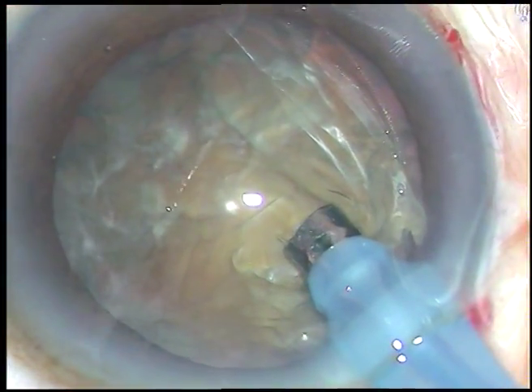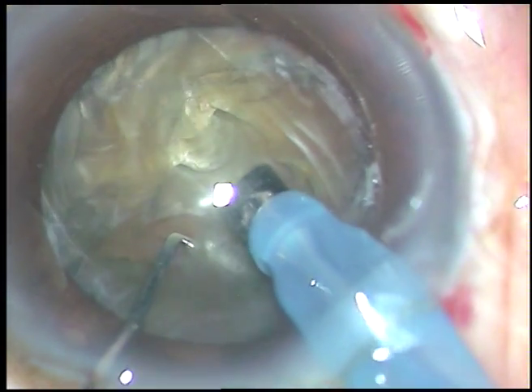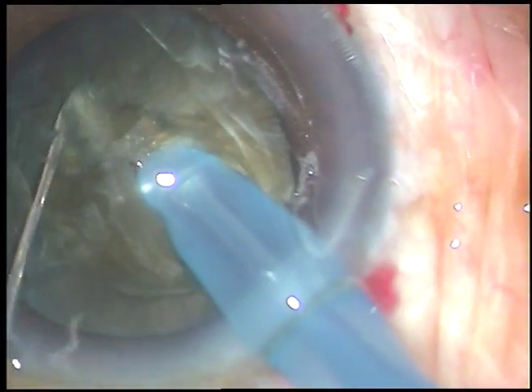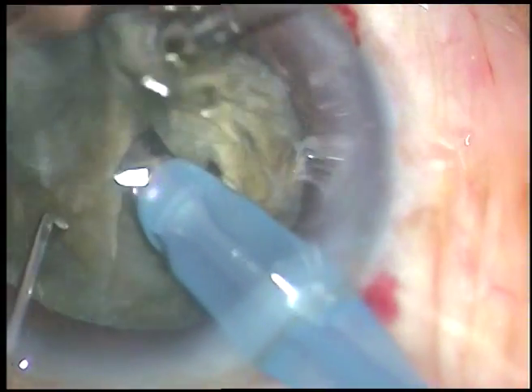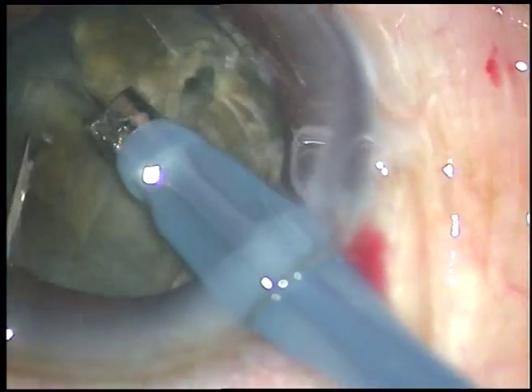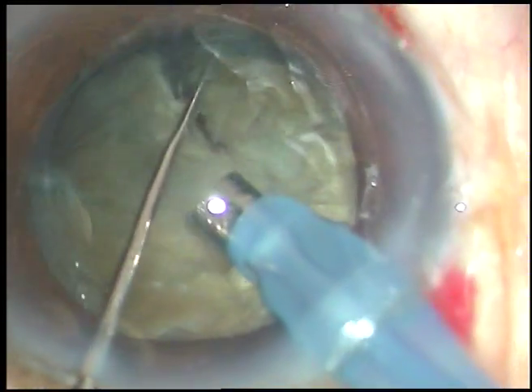Now see how I am doing direct chop. I go deep into the substance of the nucleus and travel through it towards the opposite equator. As I reach the softer portion of the nucleus I use the chopper and emulsify. This is a very small chopper — the prong at the anterior end is only 0.6 millimeters.